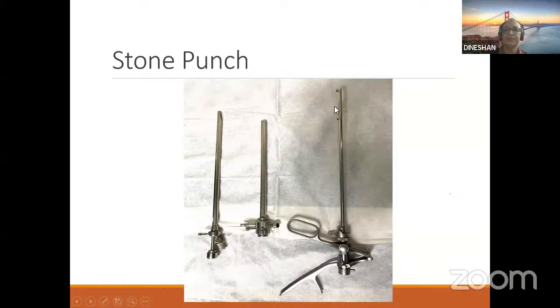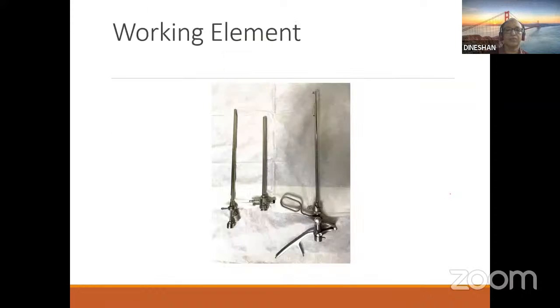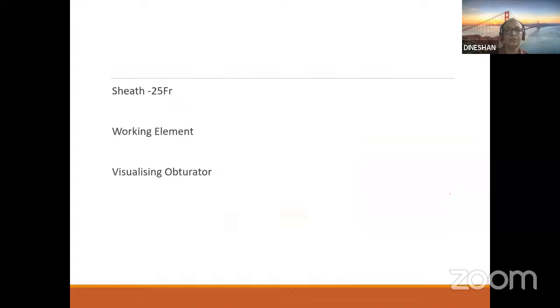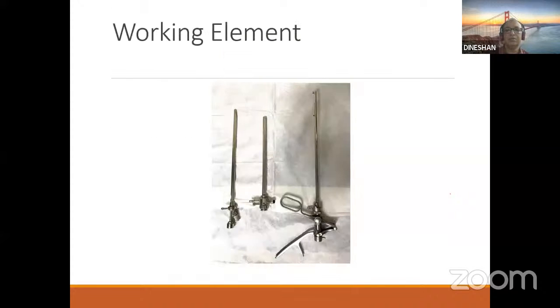This is the punch, and you can hold the stone with this beak-like structure and crush it.